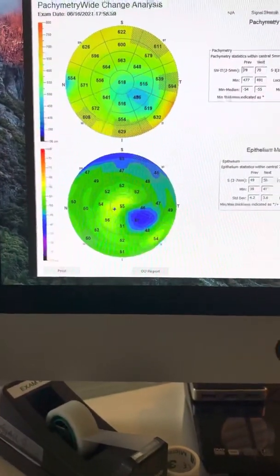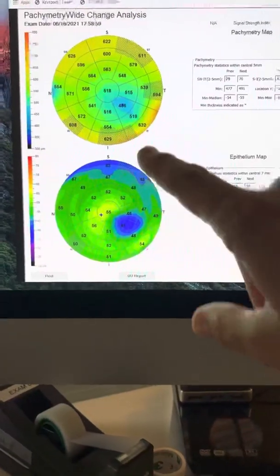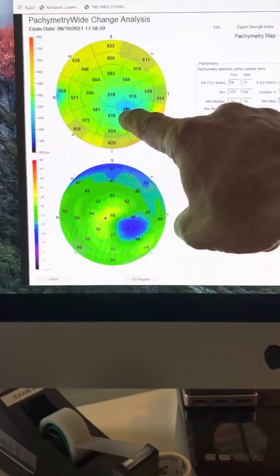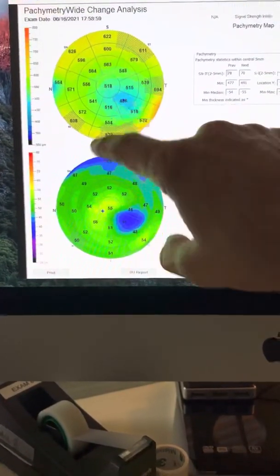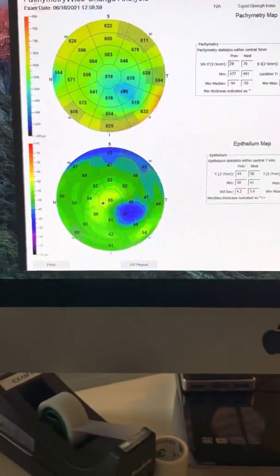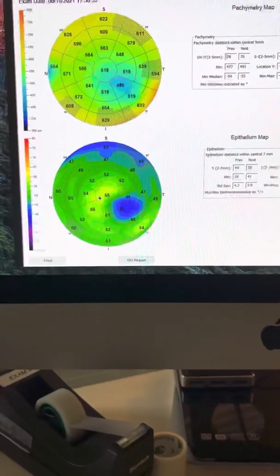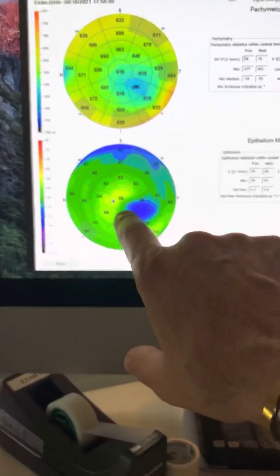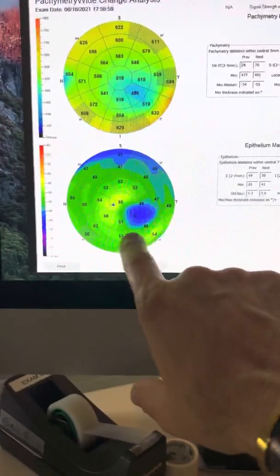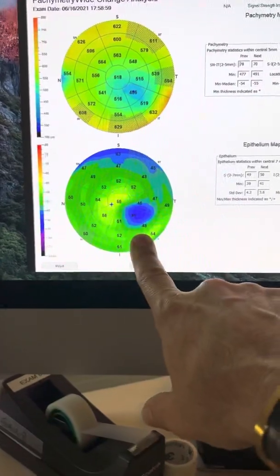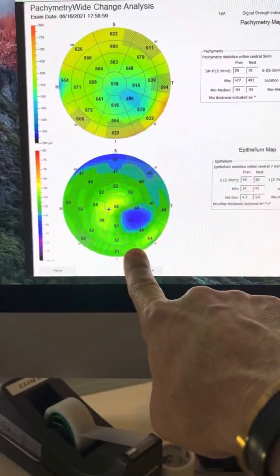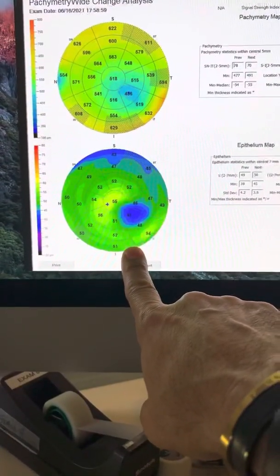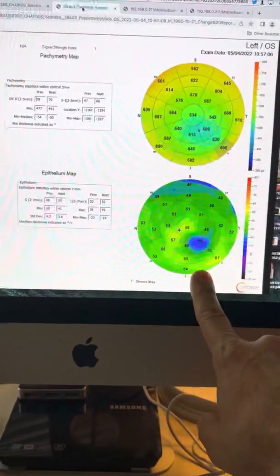Same story with the worst left eye. See his left eye last year, 486 minimum cornea pachymetry with the Optovue Avanti OCT. Best so far on the market for epithelium mapping. We can see how this picture tells us the story of eye rubbing. We reiterated, stop rubbing your eyes, even study your sleep patterns. This is him yesterday.